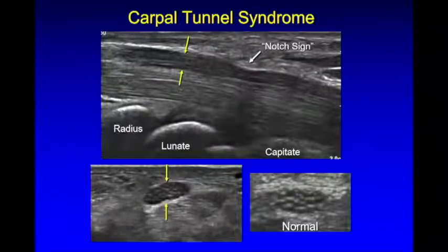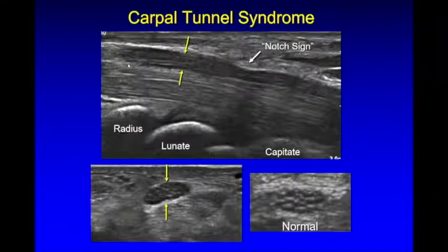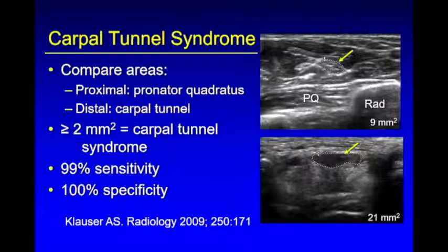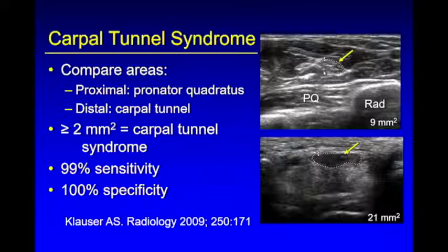Here you can see the normal nerve — this image is blown up to show the echogenic connective tissue. Here is an abnormal nerve: it is more hypoechoic because the echogenic connective tissue is less echogenic. In long axis, we can see the enlarged hypoechoic nerve being compressed under the retinaculum. This has been termed the notch sign, where there's a transition from an enlarged nerve to a smaller diameter nerve due to compression. The most accurate approach is comparing the area proximal to distal.